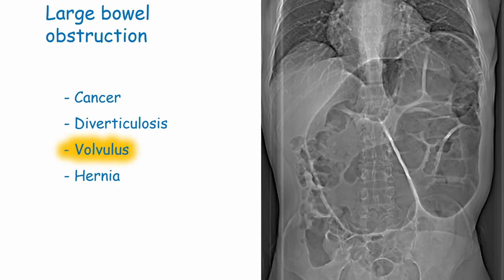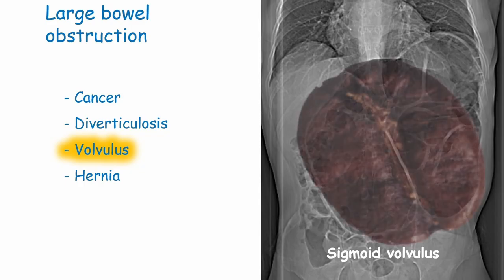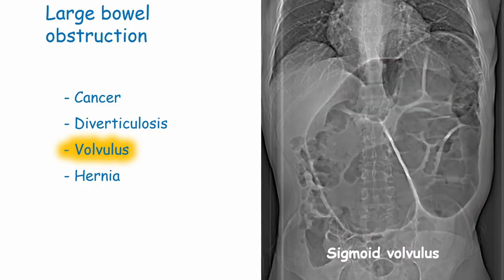In a sigmoid volvulus, the sigmoid colon twists on itself and its surrounding mesentery. The x-ray shows the classic coffee bean sign, with the loop of bowel typically pointing towards the diaphragm. Note that the proximal bowel is also dilated, as pressure builds up behind the obstruction.